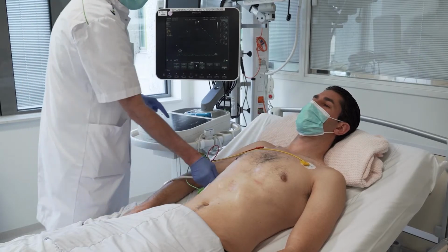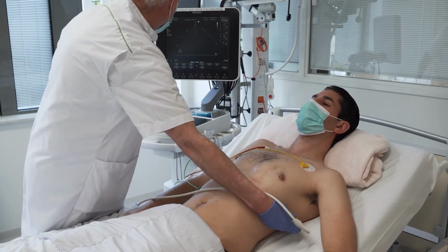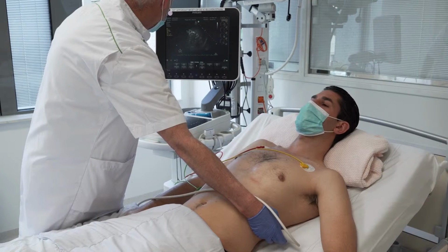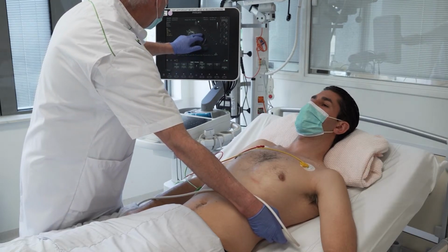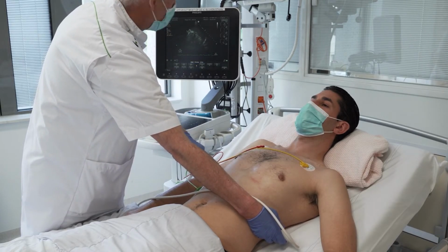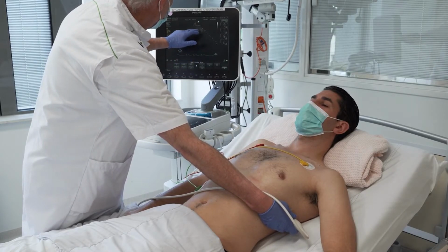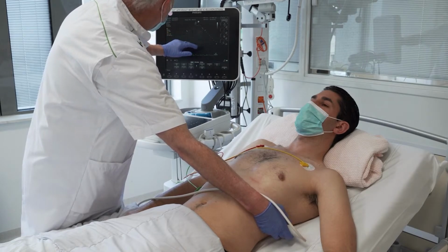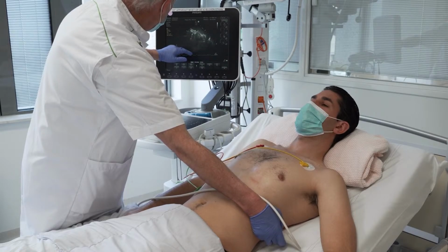We can do this the same on the left flank. Again, first we look for the diaphragm. Here's the diaphragm, here of course is the spleen, and it's exactly the same story as on the right side. First I go up, I go cranially, I look for effusions and consolidations or atelectasis, and I go down and I look for the kidney.